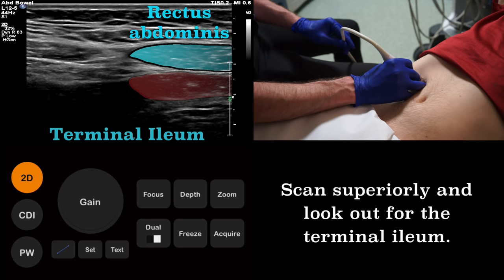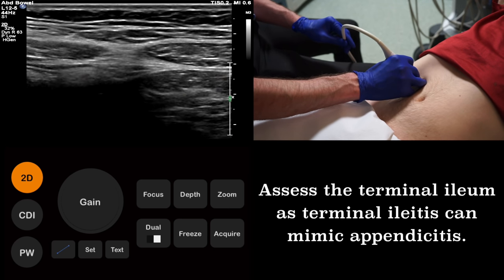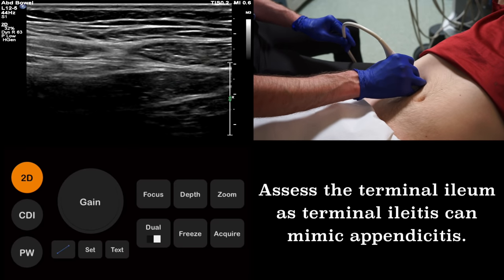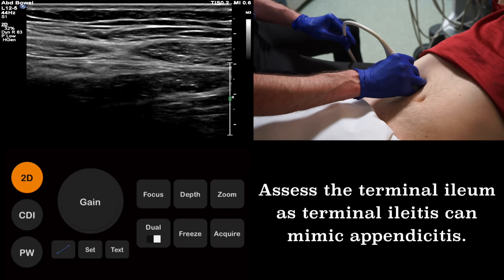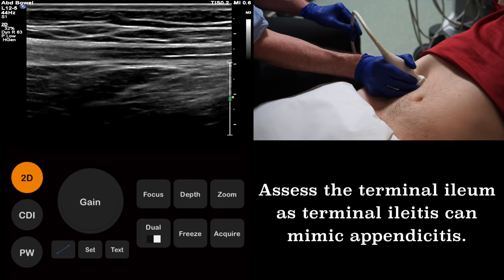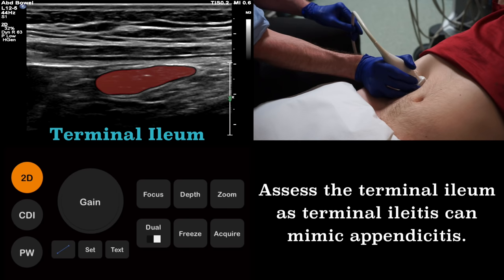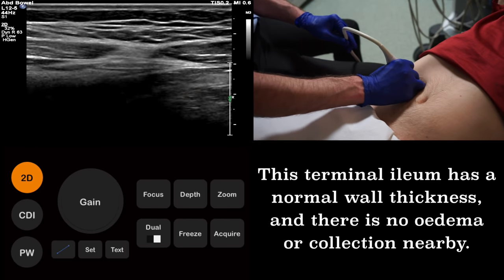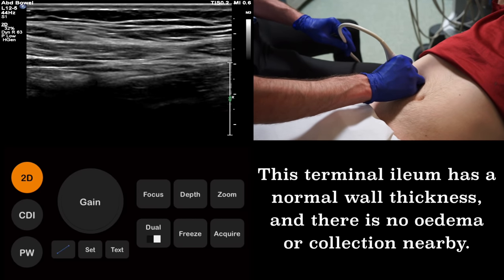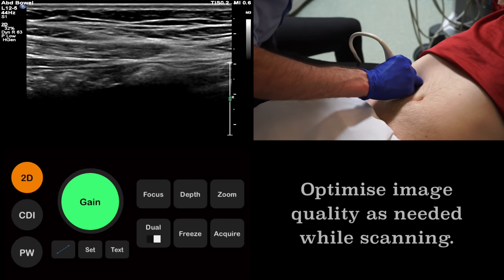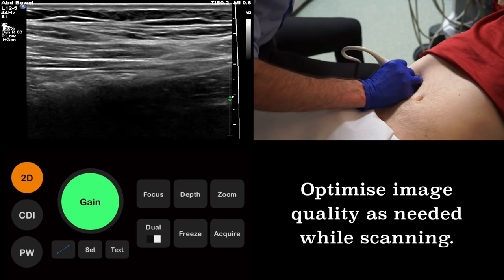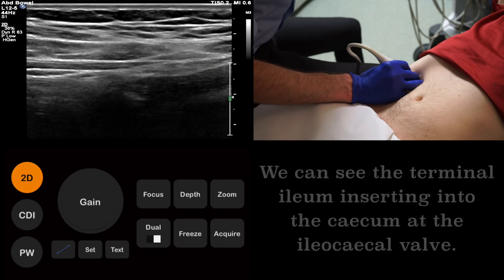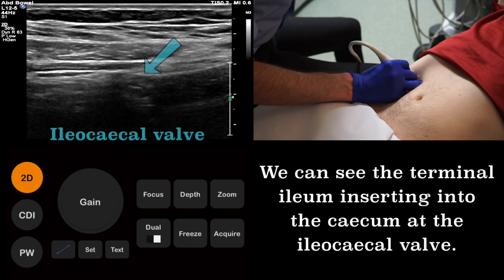Here we see the terminal ileum lying just deep to the rectus abdominis muscle. Unlike the ascending colon we imaged before, the small bowel does not have haustra, and therefore has a smooth wall contour. We image the terminal ileum in its axial plane, looking for signs of inflammation. The terminal ileum shown here has a normal wall thickness, and there is no surrounding edema or collection. We will now look closely for the ileocecal valve, taking time to optimise our image further using the gain control. This is an important landmark. The ileocecal valve defines the position of the cecum, so once we have found it, we know that the appendix must arise nearby.